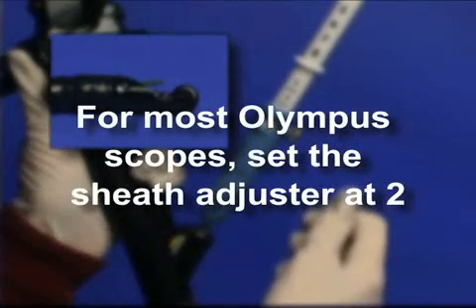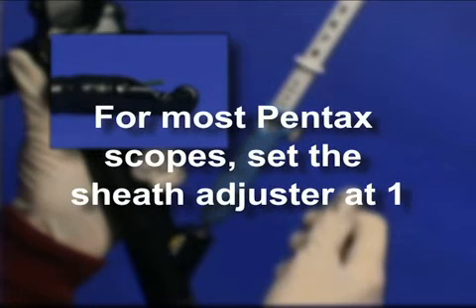As a starting reference, for most Olympus scopes set the sheath adjuster at 2. For most Pentax scopes, set the sheath adjuster at 1.